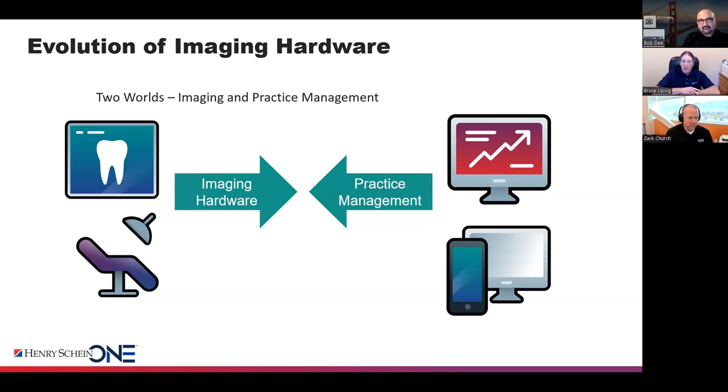It's funny how this works because when we look at ourselves versus some of our competitors, we have to first start by separating on-prem solutions from the cloud-based solutions. There are a lot of hardware manufacturers that make imaging software for their on-prem solutions, but they don't have cloud capabilities. So when we came forward to make imaging applications, we knew we needed to have open architecture to be able to plug in all kinds of different devices.